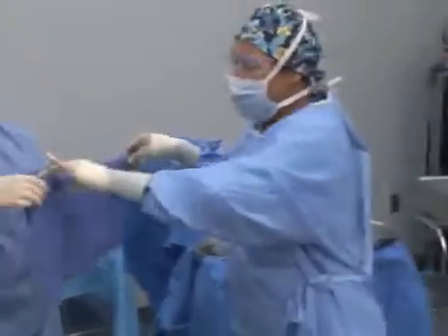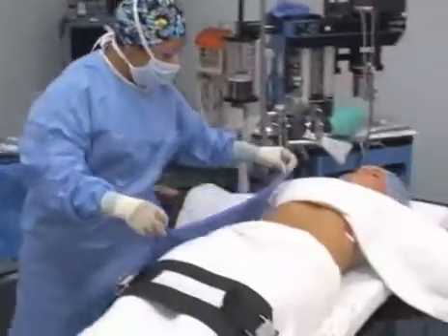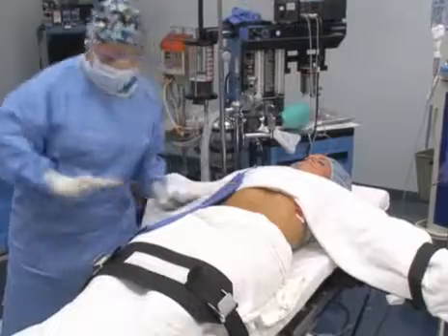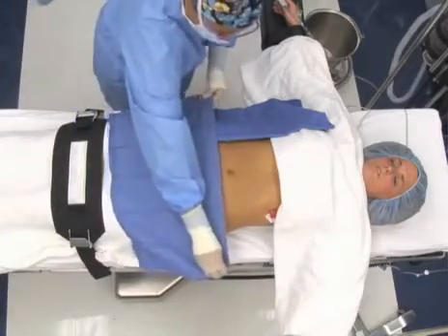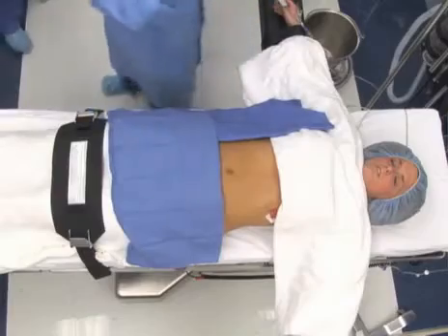The procedure for draping the abdomen is one of the most common draping techniques and may be used for many surgical procedures regarding the abdominal cavity. Surgical towels made of heavy absorbent cloth are used to make a frame around the incision site. Towels are folded along one edge before positioning them on the patient. Framing the incision means providing an opening in the drapes for the incision.